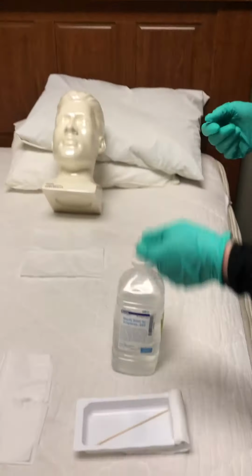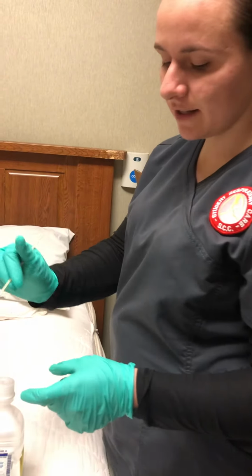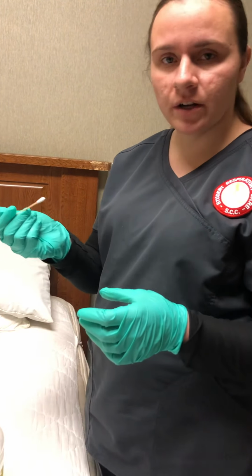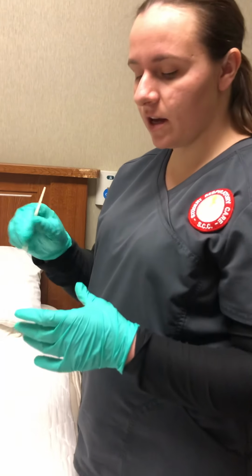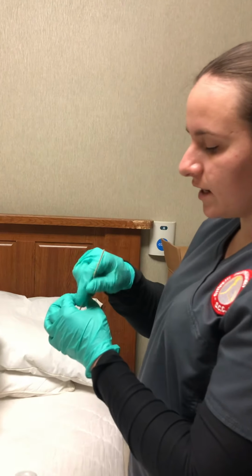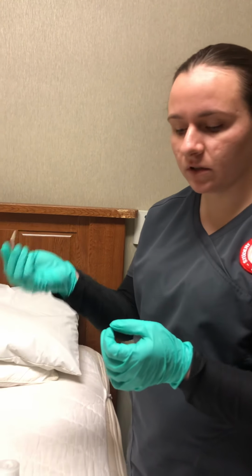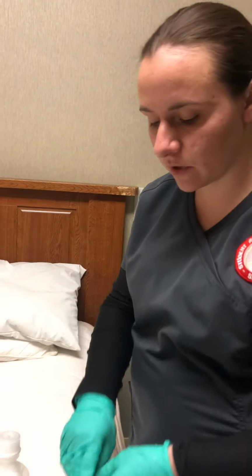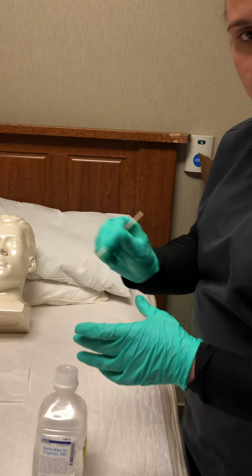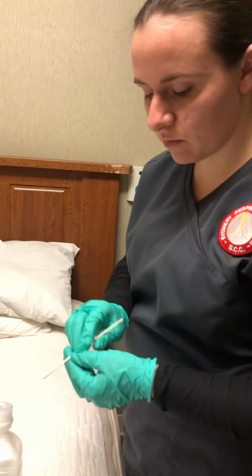So if it's a non-disposable one that can be removed, then you would take your peroxide and take a pipe cleaner or a brush that may be in your kit. You take your peroxide and go inside and clean everything. After you're done, you would dispose of the one you used to clean it with, and then you clean it out with normal saline, just to make sure that the peroxide's out and it's not going to harm the patient when you place it back in.